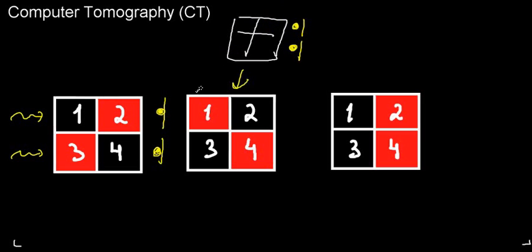And if I do the same to this square here, I radiate it, I'm going to get essentially the same reading for these two axes, because here I have also one square, and here I also have one square. So this square and this square, if I radiate only in the x-axis, they look the same to me.